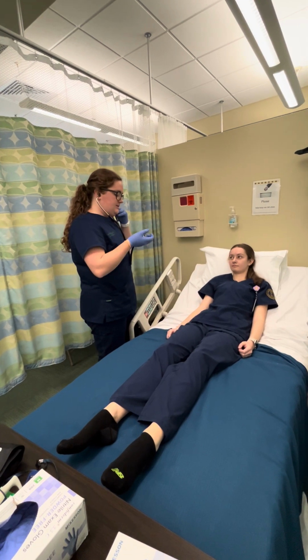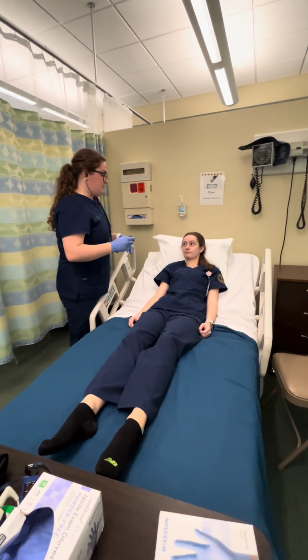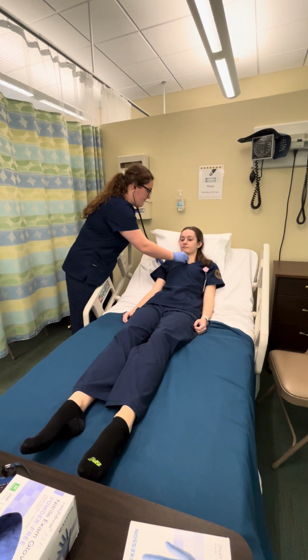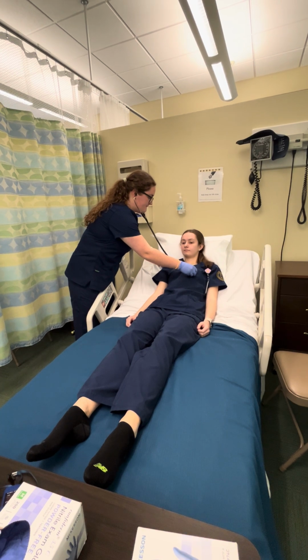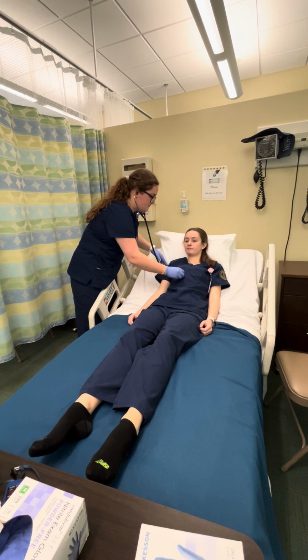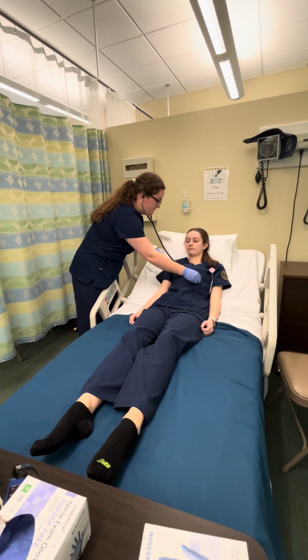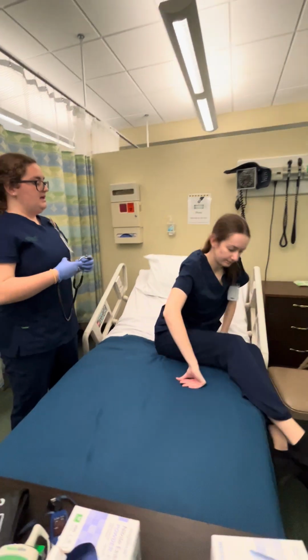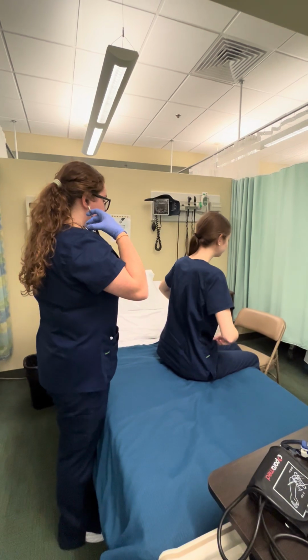I am going to be listening at the front in 6 spots, and I'm just going to have you take a deep breath in and out each time you feel the stethoscope. Okay, and then I'm going to have you sit at the edge of the bed facing that way, and I'm going to listen on your back and on each of your sides. And do the same, taking a deep breath in and out.